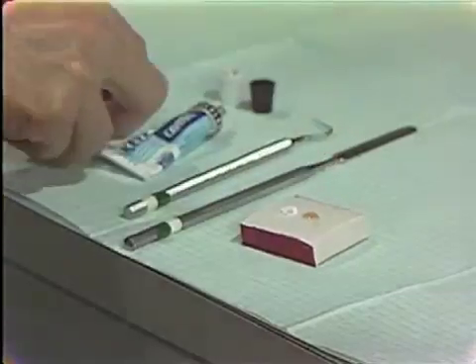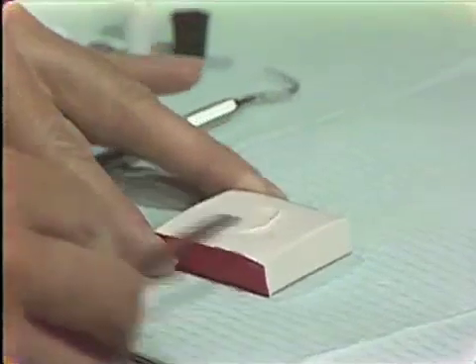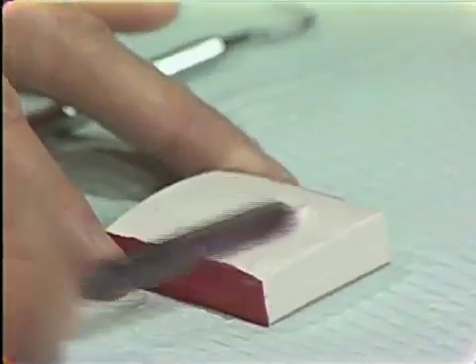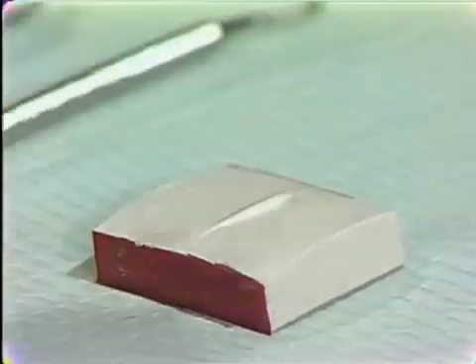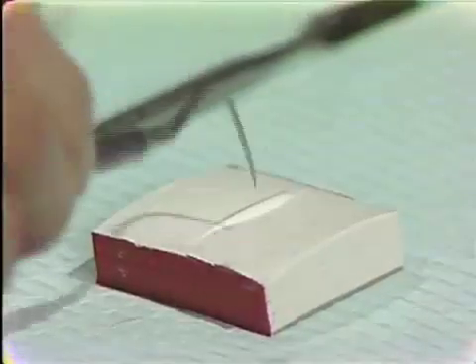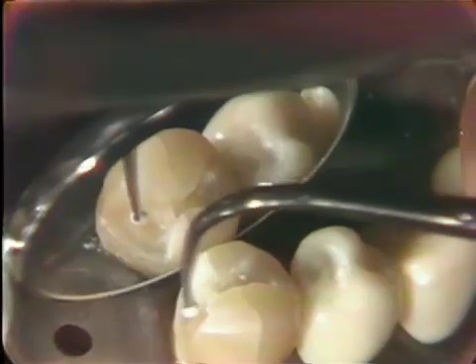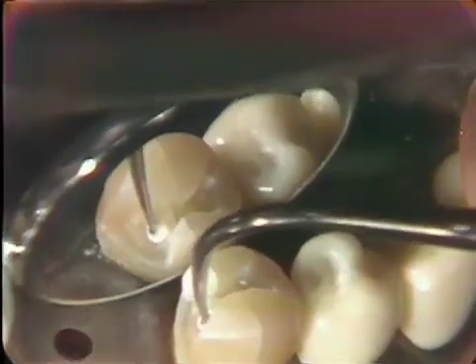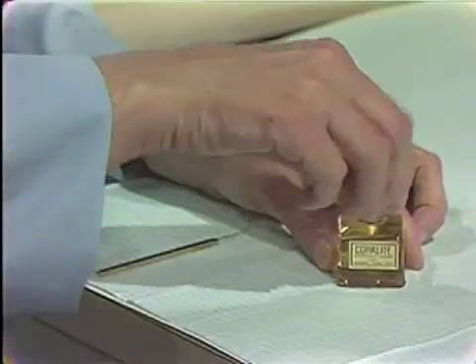In this case, we are using Cavitec. This has two purposes: soothing the tooth as an obtundant, and also providing added protection against the acid of the zinc phosphate base. A small amount is picked up on the end of an explorer, a spoon excavator, or here a small ball burnisher, and placed just into the deepened area.